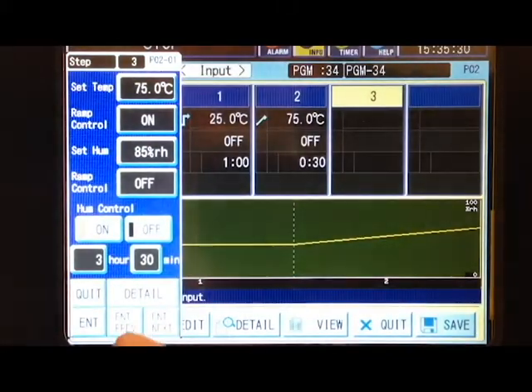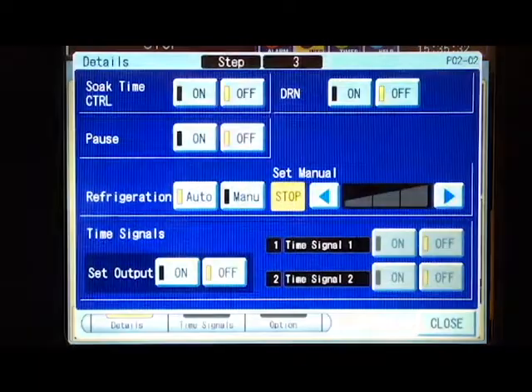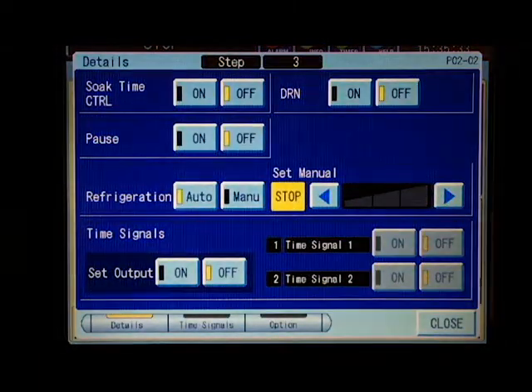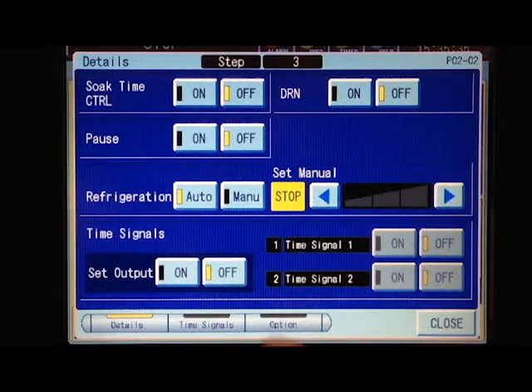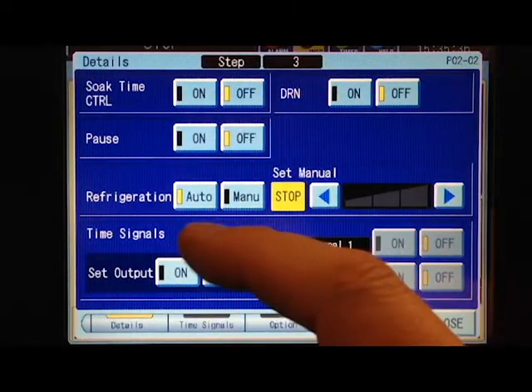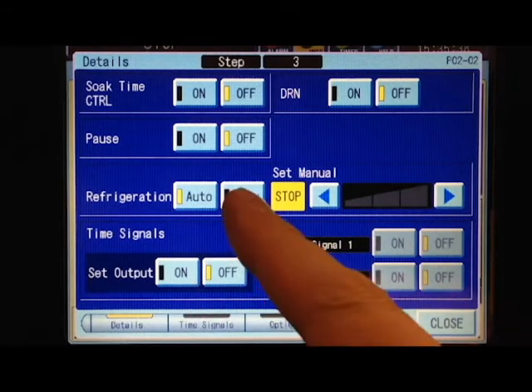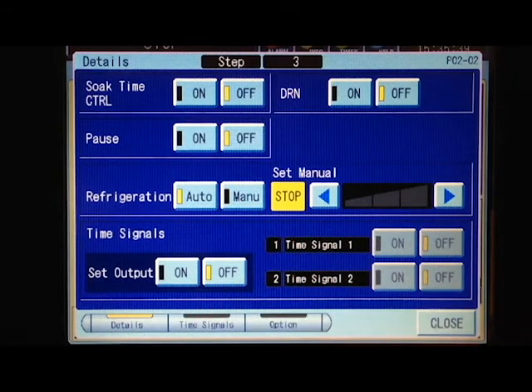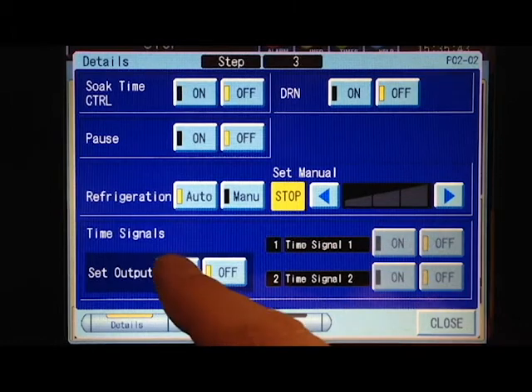If you want to make additional changes, you can use the detail tab. That gives you soak control, pause, refrigeration—always leave that on auto—and time signals. Time signals allow you to turn on external devices with each step.